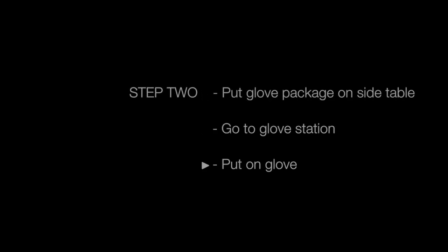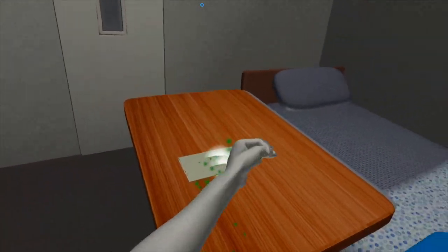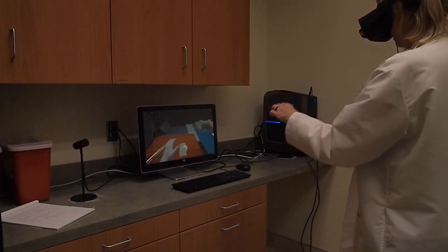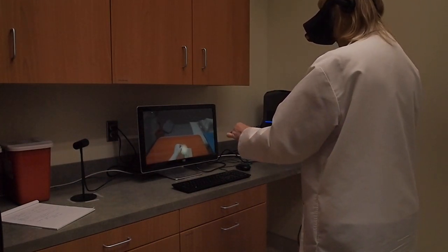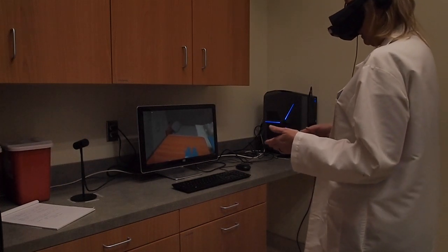Next, we will unwrap the gloves and put them on. When we pick up the gloves, we try to set them as far as we can onto the center of the table next to us, because it's easier to open the package from that angle. Then press glove and the gloving package is in front of you. Open the glove to the left — it may look like there are no gloves, but they're really there. Open all the way to the right and the gloves appear.